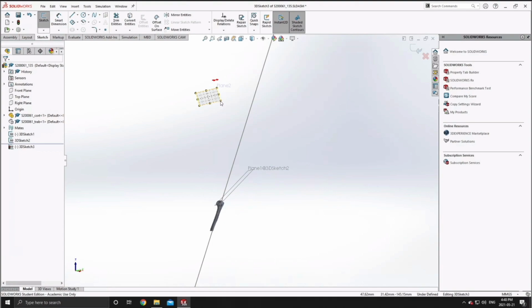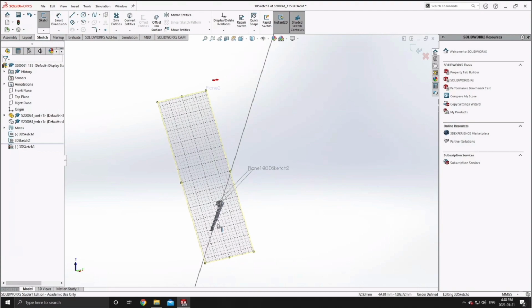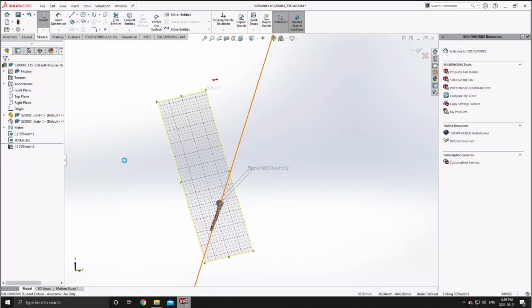So as we progress here, we're just going to make use of the mating relations properties of SolidWorks. So right here I'm creating a plane orthogonal to our retroversion angle, and this will isolate the retroversion while discarding the anatomical neck angle, which we're not going to be using going forward. This will allow us to sketch a neck shaft angle relationship between our resection plane and the predetermined central axis that we created earlier.